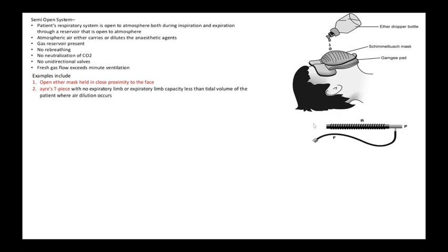So this was the disadvantage, and I use this mainly again for spontaneous breathing in very small babies with weight less than 5 kilos. We thought it should have no valves at all. So in the exam, they ask you what is the difference between the other circuits and Mapleson E or Ayre's T-piece. It is a valveless circuit, so there is no resistance at all, but it requires a very high flow to avoid rebreathing of the exhaled gases.